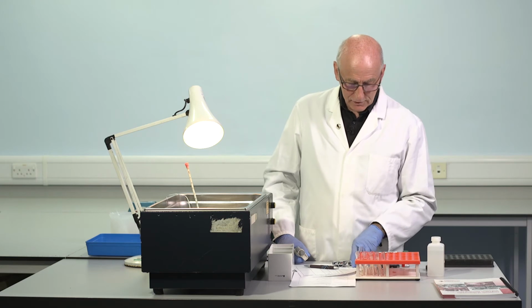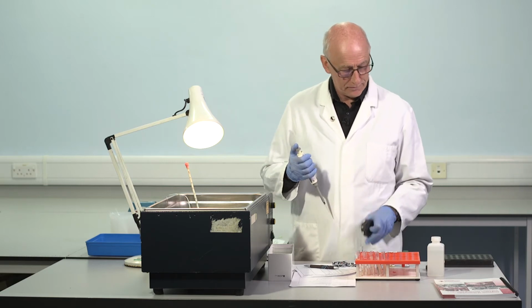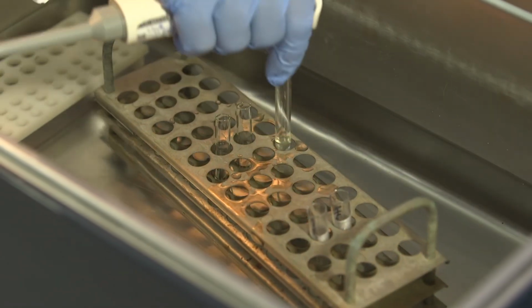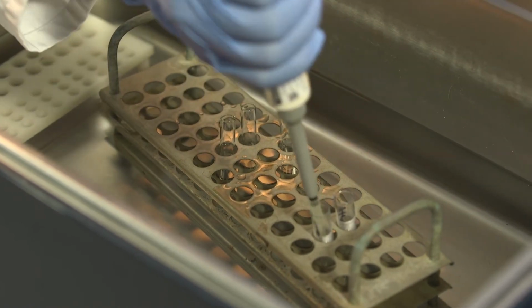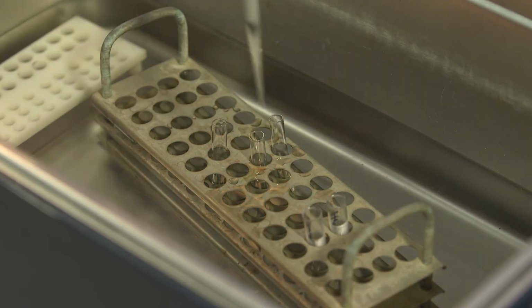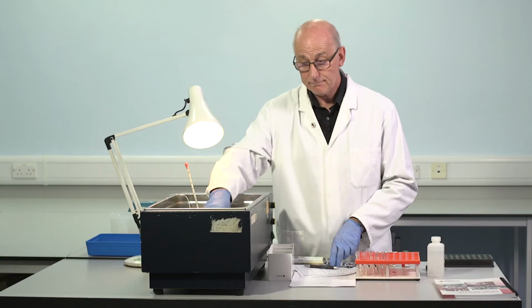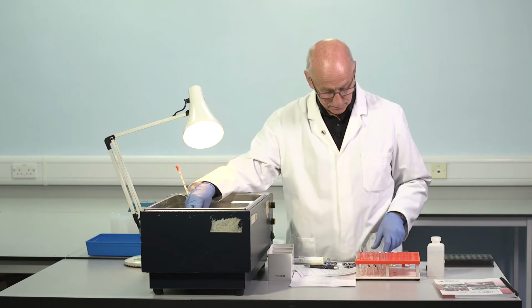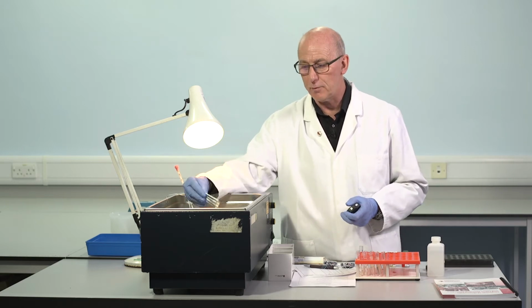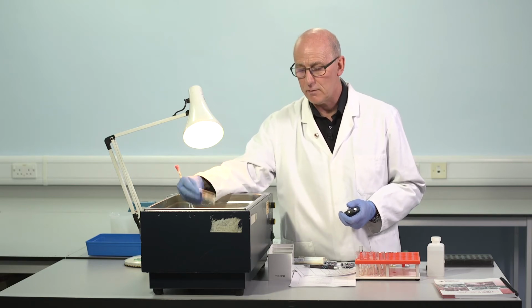If the assay is performed with a reagent largely unaffected by lupus anticoagulant, then there still can be other interfering substances which cause this problem. For example, anticoagulants like heparin, like the new direct oral anticoagulants, rivaroxaban, apixaban, dabigatran. All of these can cause interference and a similar effect, falsely prolonging clotting times, leading to potential for serious underestimation of the real concentration. And this is apparent only if you test multiple dilutions, 3 dilutions, so that you can see this non-parallel effect that we'll come back to when we look at some plotted results.